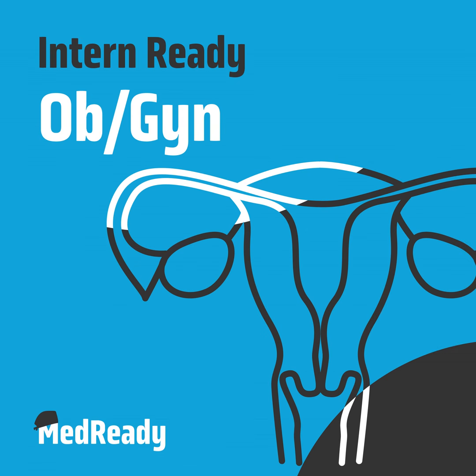I will say I feel like most attendings won't really go up to that amount. They'll start to get a little nervous as you get closer to 1.5 liters. That obviously just depends on your attending and their preference. For patients that have comorbidities or elderly patients who have bigger sensitivities to giant fluid shifts, you might even see people stop at 750 cc's or a liter, just so that they can ensure that they don't have an excessive fluid shift that they won't tolerate.